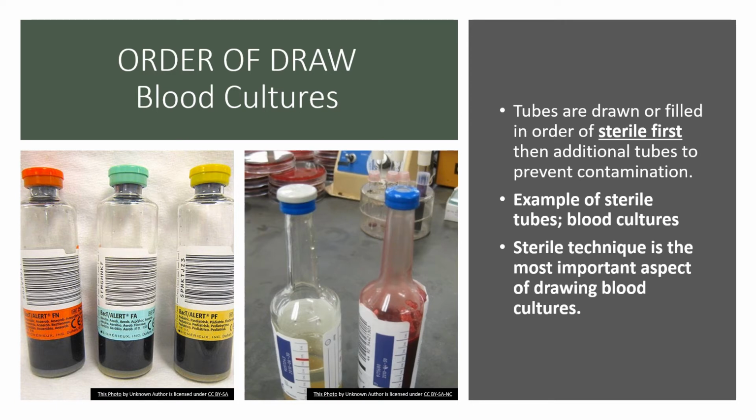And then above that, there's media in these blood culture bottles, okay? This media is there to provide the best environment possible for bacteria to grow. We want to give this bacteria all the nutrients that it needs, so if it is there, it will grow, okay? That's why you store these blood culture bottles in the incubator, because we want them at body temperature, right?